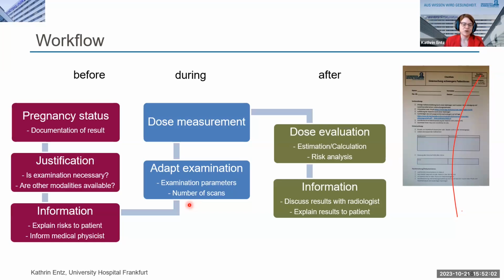For years, it was recommended to use lead aprons or other things for scattered radiation. But nowadays, in most countries, it's not advised to use them anymore. It's always a bit difficult. If they're not in the scanning range, then of course you can do it, usually just for psychological reasons. Because most of the time radiation is also scattered inside the body, so they are not really helpful. But as I said, for psychological reasons, they are usually very helpful.